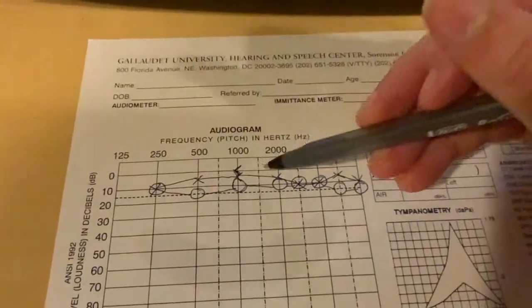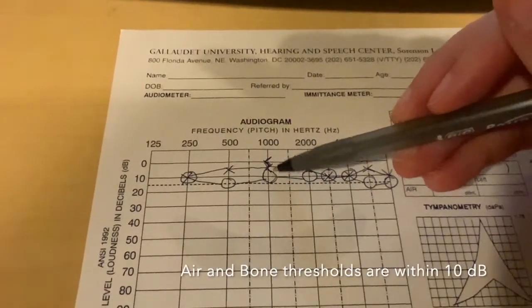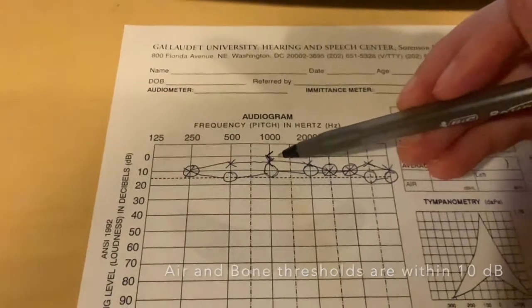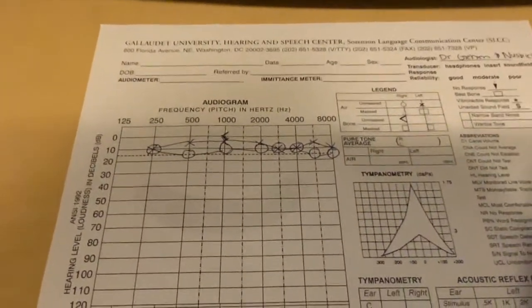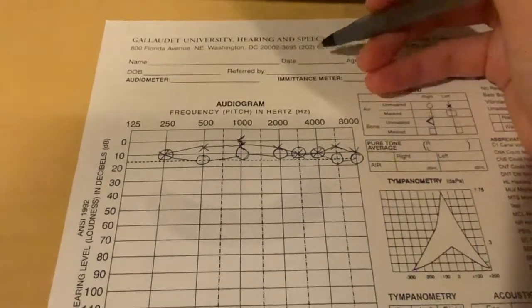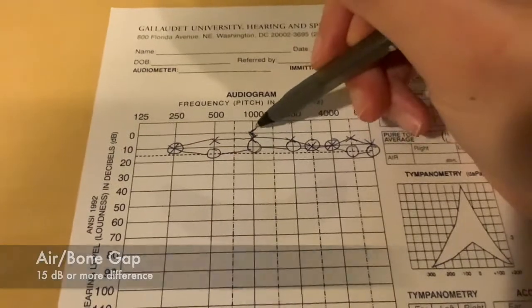And the air and bone conduction thresholds are within 10 decibels of each other. So that is normal. There's no significant air-bone gap. A significant air-bone gap is if there was a 15 or more gap between the air conduction thresholds and the bone conduction threshold.